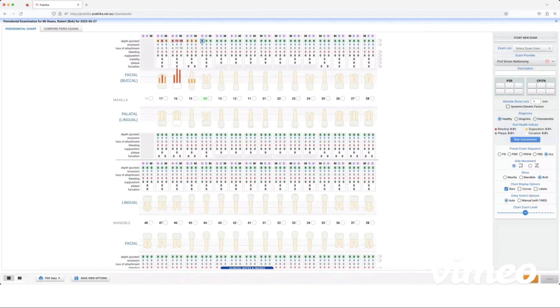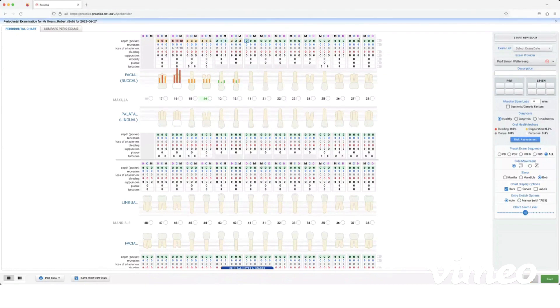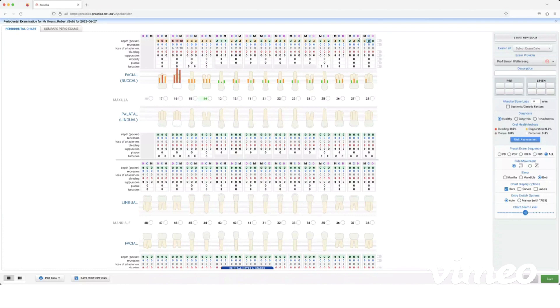So charting along here for your pocket depth in the green area, I can go through and chart all of my numbers.